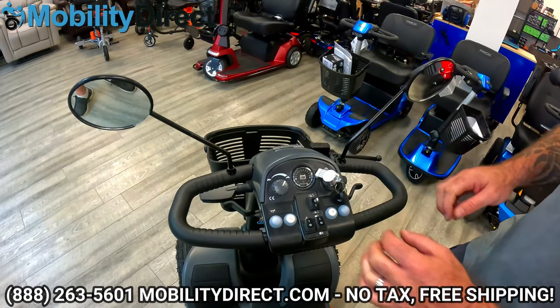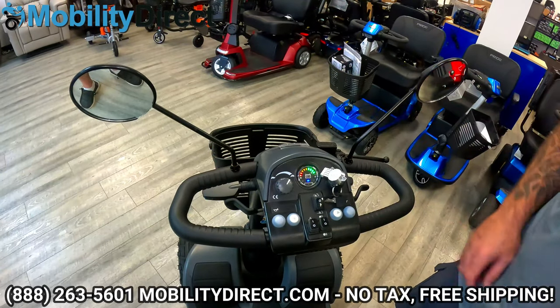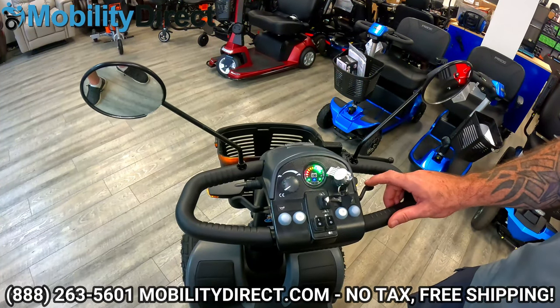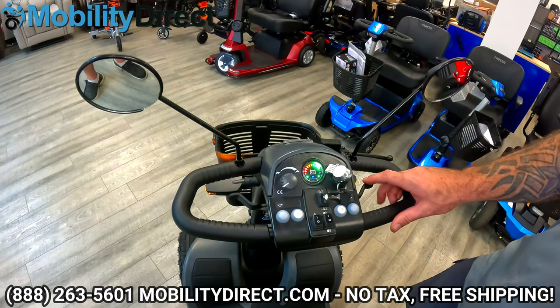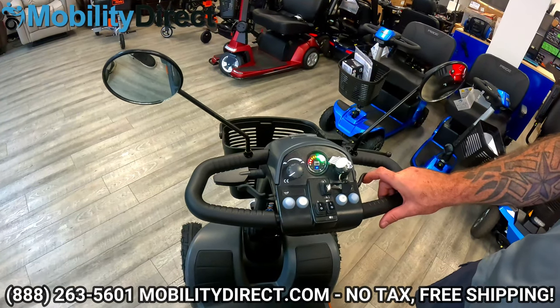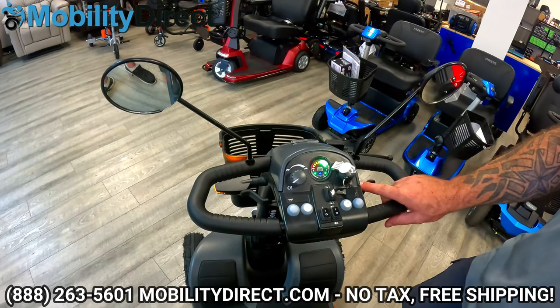So how do we use the scooter? It's very simple. All you do is take your Pride Mobility key, insert it into the ignition, and turn it on. This is your speed control as we discussed earlier, and what it's controlled by is this little throttle — also known as a wigwag. It is ambidextrous and can be used with one hand. You can squeeze it to make the scooter run forward, or use your index finger to push it and make it go in reverse. The scooter can be operated by a left-handed or right-handed user.